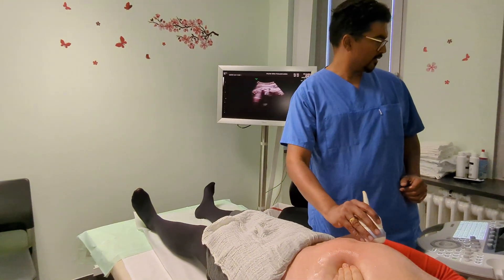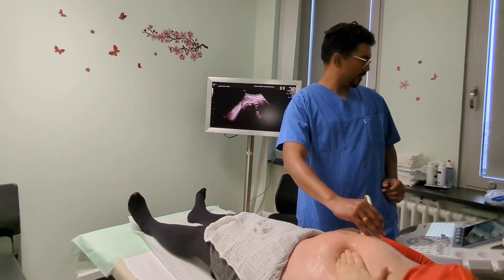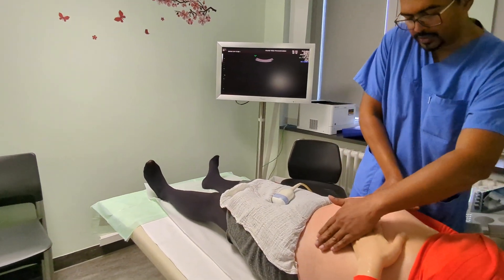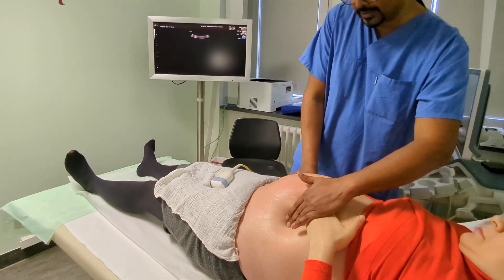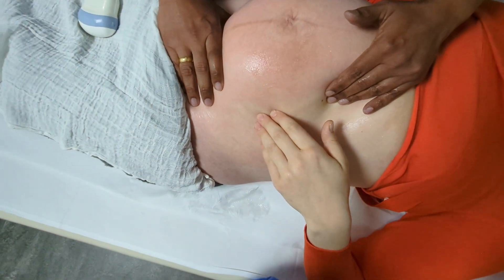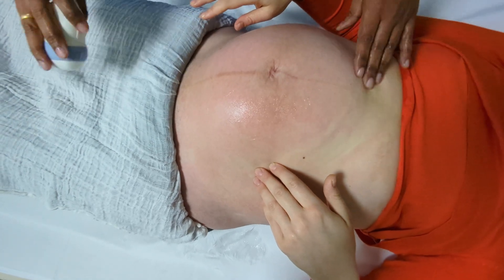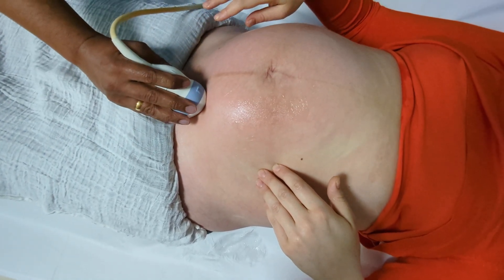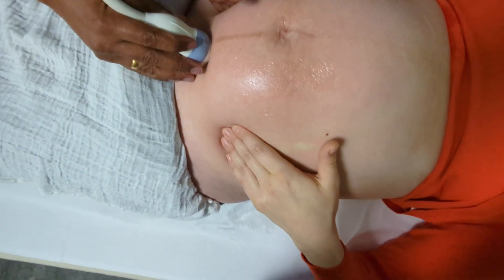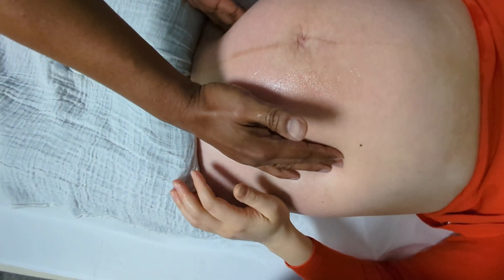Well done. The heart's beating really nicely and the head is coming into position. I'm just going to help stabilize. You can relax — you did it! That was amazing. Well done. We just wait a little bit because the head needs to come down a bit further, so we keep the head in position. Keep breathing with deep breaths in and out.